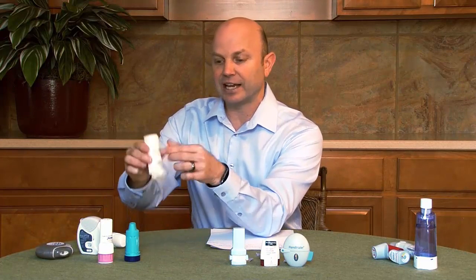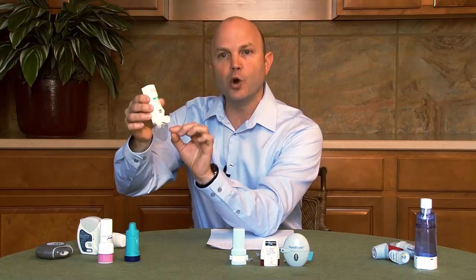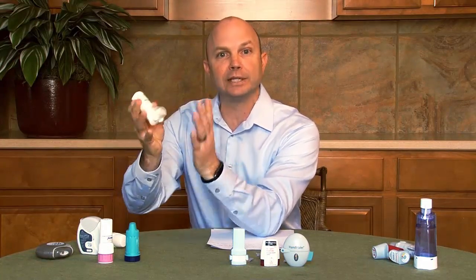Other devices like this one, as soon as you open the cover and hear the click, you actually load that medication. So it's really important to understand how each of these work, and not all caps are created the same.